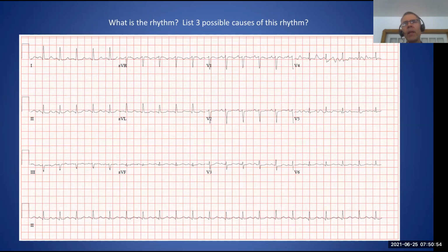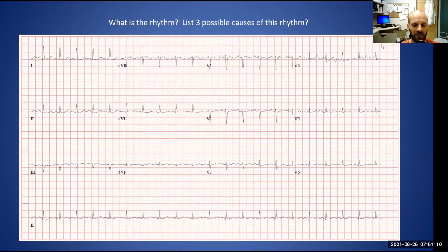Has there been any work on merging leads? Yes, absolutely. The project that we've been doing together, looking at the signal averaged ECG, is a merge of those leads. So it does things in a slightly different way. It's not only merging different leads simultaneously, it's also merging leads temporally. It's averaging beats over time to give a composite signal. So that's exactly what the signal averaged ECG is.